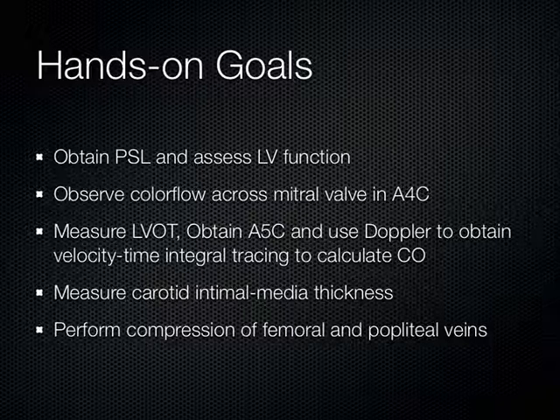I want you guys to measure the left ventricular outflow tract back in the parasternal long, get that LVOT diameter, plug that into the calculations package, switch over to apical 5, drop the Doppler on there, hit the trace, and watch how cardiac output pops up on the screen. I want you all to get that in your hands, march through that during our hands-on. Look at that carotid artery to where that intimal medial layer would be on a non-young person, and then finally get in the groin, get in the pop on your models, do some good compression ultrasound there, and do some augmentation, and watch how easy it is for those vessels to collapse.